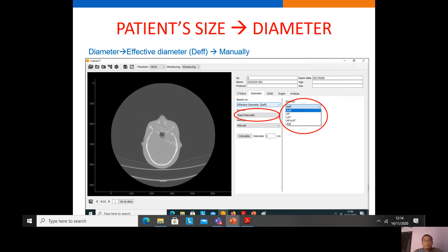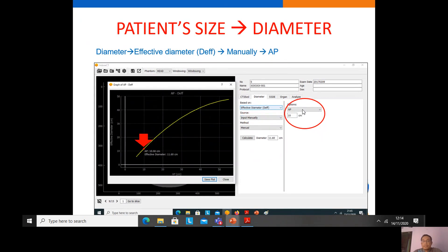For example, if we have the AP diameter of 10 centimeters, we write 10 centimeters and then calculate. We get the effective diameter of the patient — 11.6 centimeters — and we also have a curve of the effective diameter versus the AP diameter.